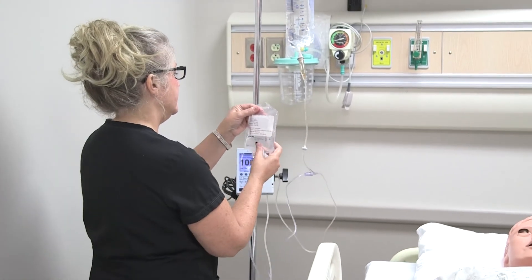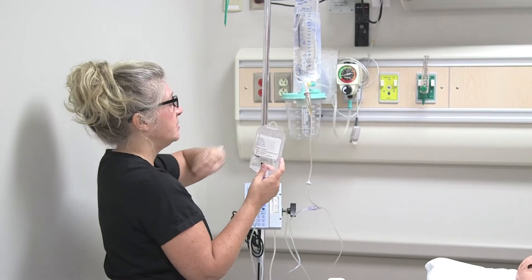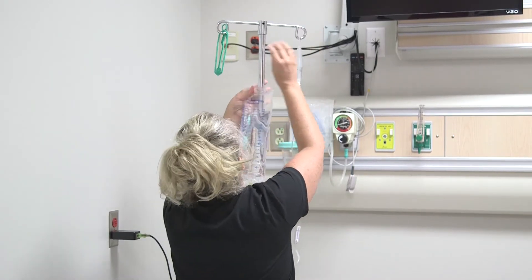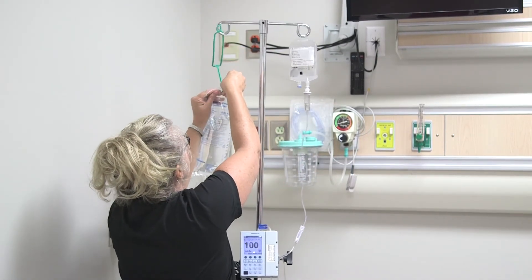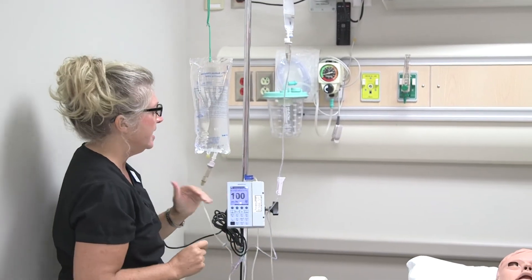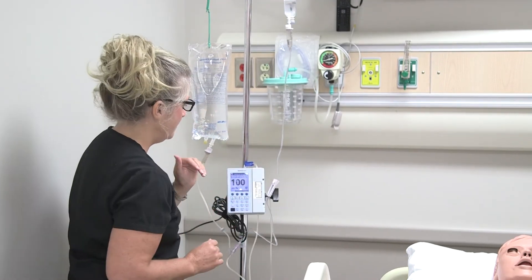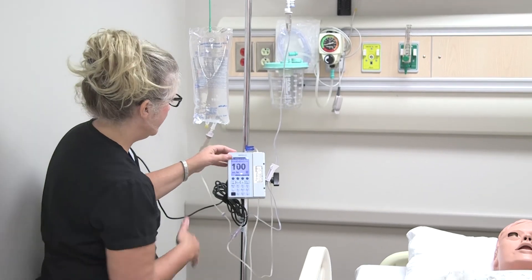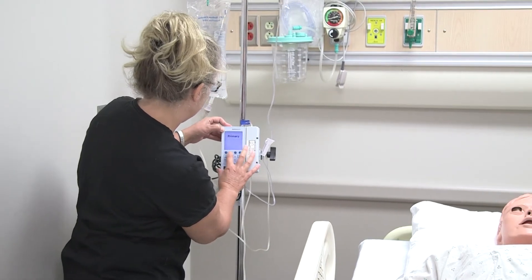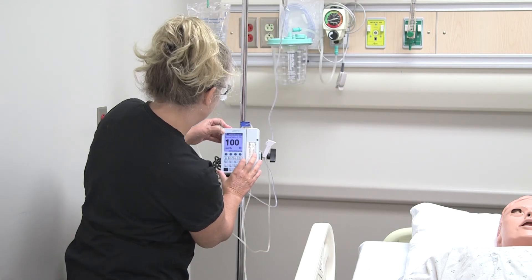The next step is that since this is our secondary or piggyback, it needs to be higher than our primary. So we're just going to switch these two — place the primary bag lower. Now we have our piggyback above our primary. Make sure you open up your roller clamp, otherwise it won't flow. Then we go ahead and select our secondary piggyback on the pump.